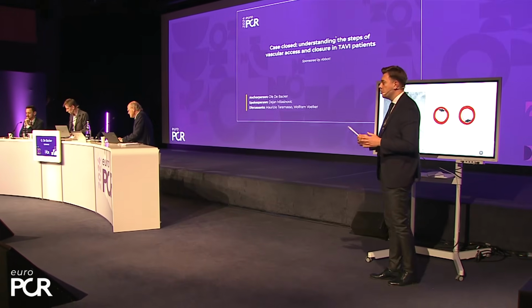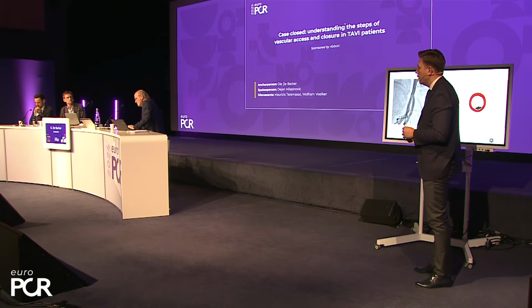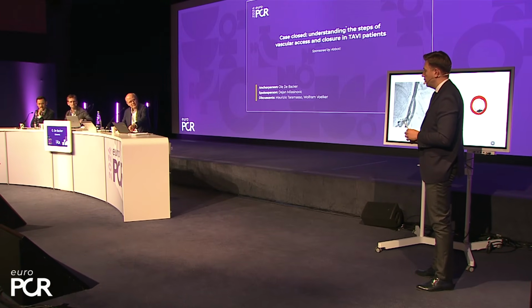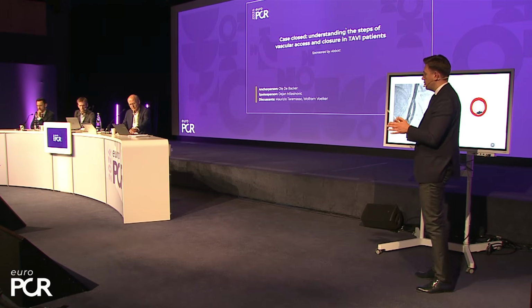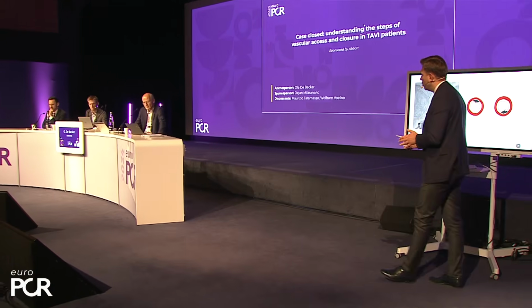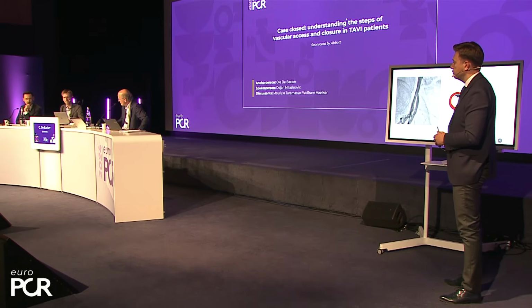I think one of the most important questions here, because you brought it up and you said ultrasound guidance is important, is I would like to know the opinions of Maurizio and Wolfram. What do you think about that? Do you use ultrasound guidance because you think it's almost mandatory if you want to perform suture-mediated closure? Or do you still rely on angio guidance as well?